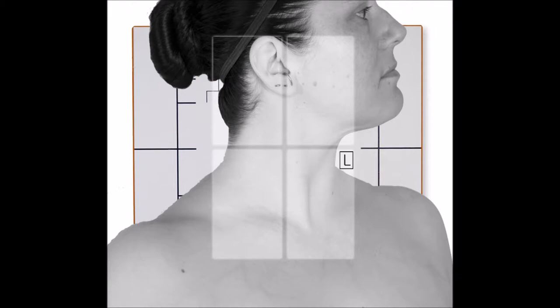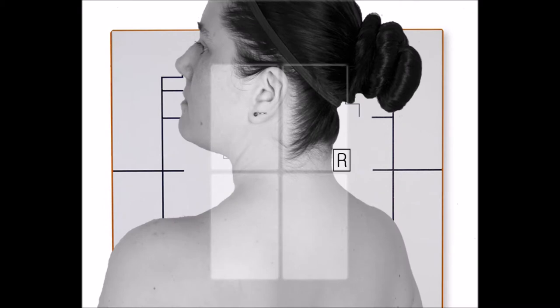The positioning for both are generally the same. Both require the body and head to be at a 45 degree angle from the IR. The midsagittal plane is aligned with the centerline of the IR.